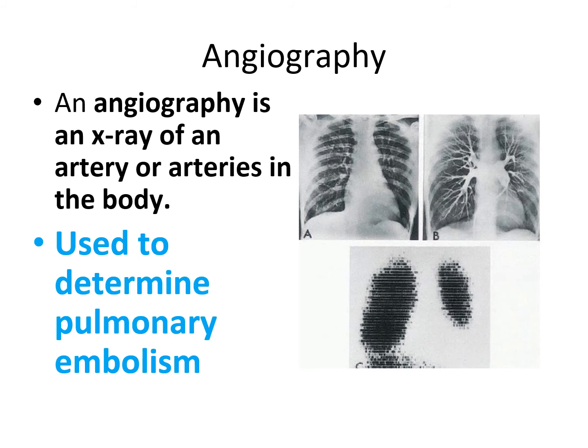Then in the lower picture there, they would inhale a gas that had radioisotopes in it, and that would be used for a ventilation perfusion scan, basically. But we haven't used that for a really long time. What they now use is CT angiography. There's no catheter needed for that. This definitely has replaced the pulmonary angiography and your VQ scan.